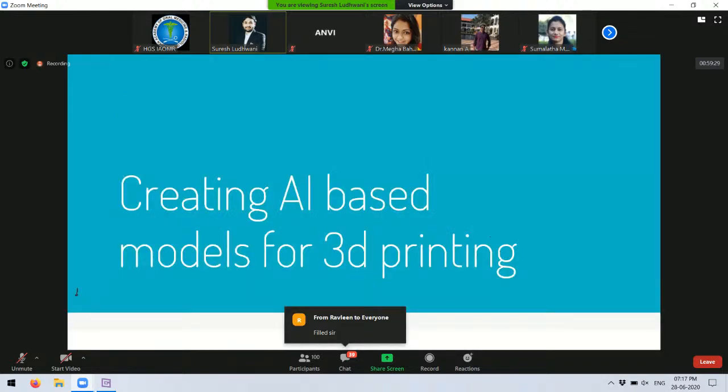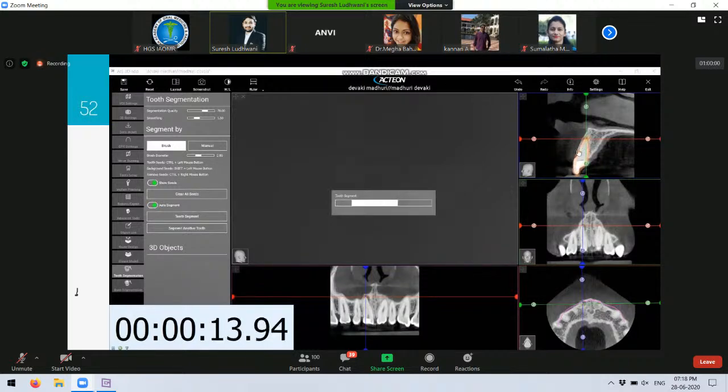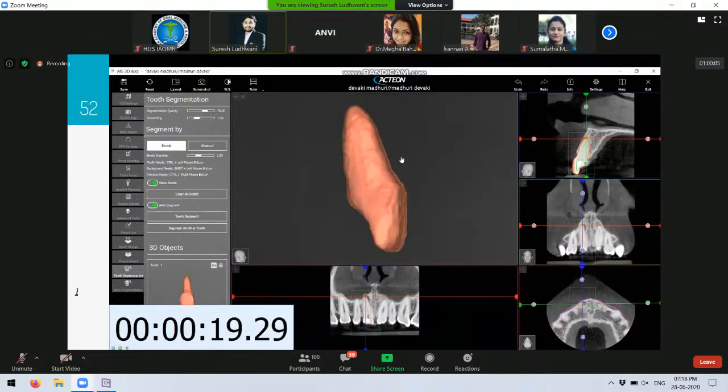So there is one more thing which I wanted to show, that in case you want to create models for 3D printing, how does AI help in it? Like, as I told you, what is the segmentation process? So you can see over here, this is a video which was prepared. You can see on the downside, what I'm doing is I've automatically marked the tooth, and it will directly segment the tooth.